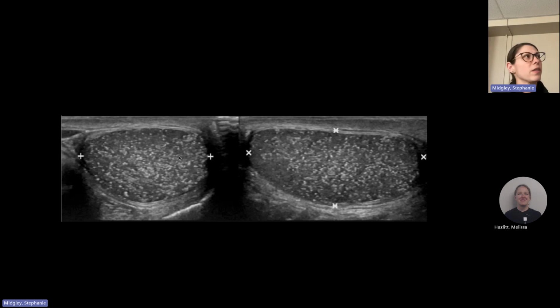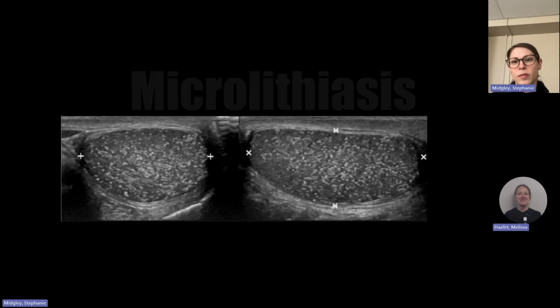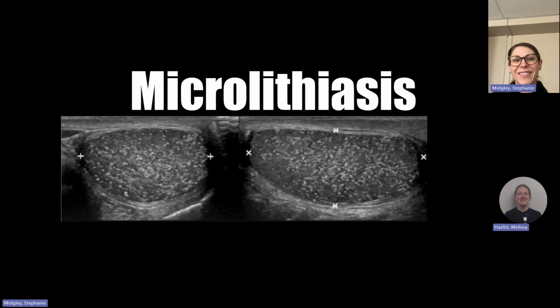All right, what do we have here? Have you guys encountered these yet? Microlithiasis. So just small testicular calcifications cause non-shadowing echogenic foci within the testicles. Basically, it's like hydroxyapatite concentrations within the lumens of the seminiferous tubules. It used to be thought to confer a higher risk of testicular cancer and needed screening testicular ultrasounds. Now, the data is a little more controversial.